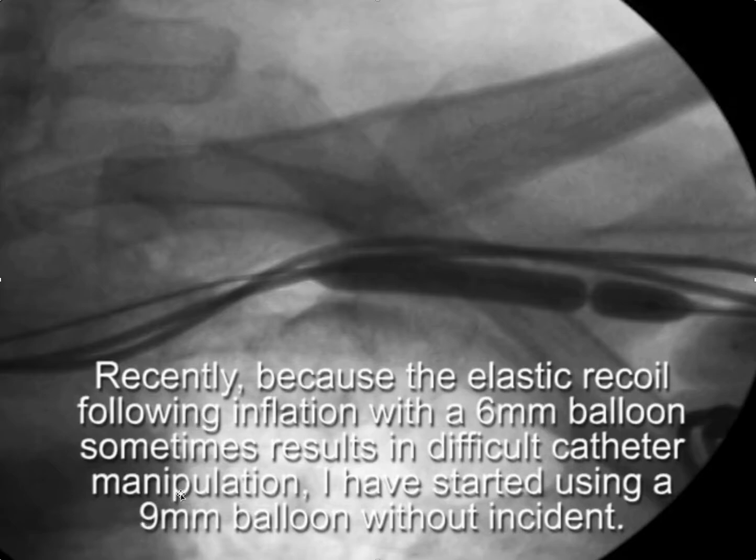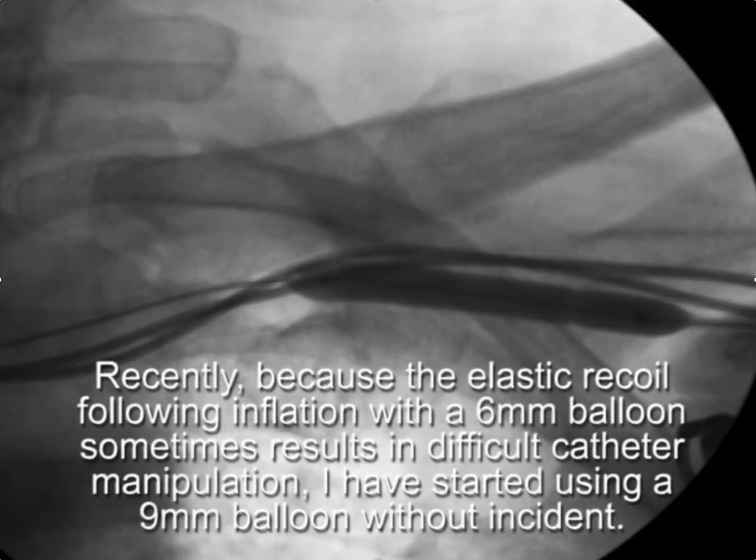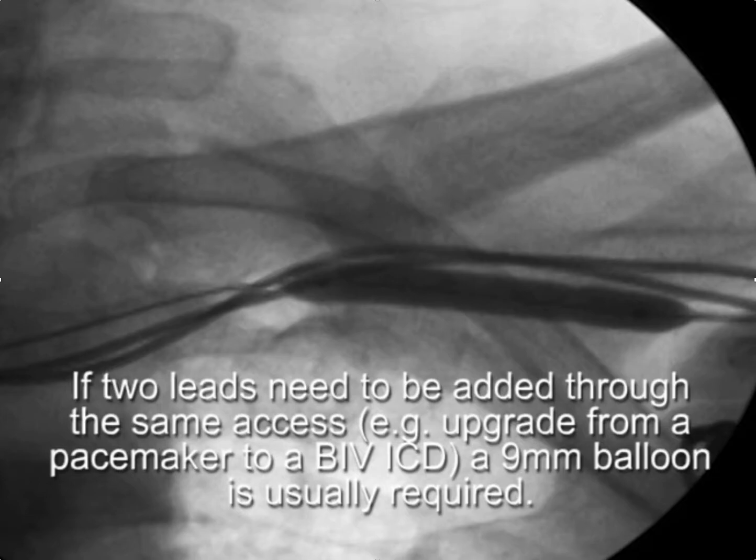Although over the years I've had the most experience with 6mm balloons, I've found that the 9mm balloon is less likely to leave any elastic recoil, so I've started going to the 9mm balloons more frequently. Some of my colleagues actually start with a 10mm balloon and have no trouble with complications.